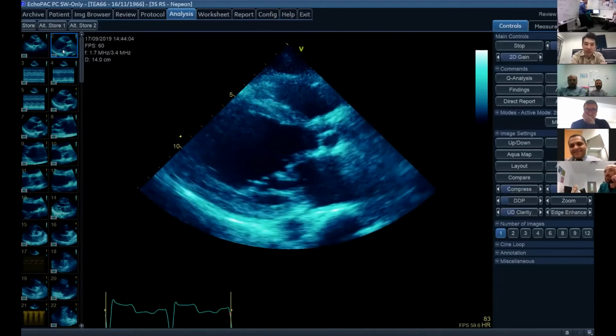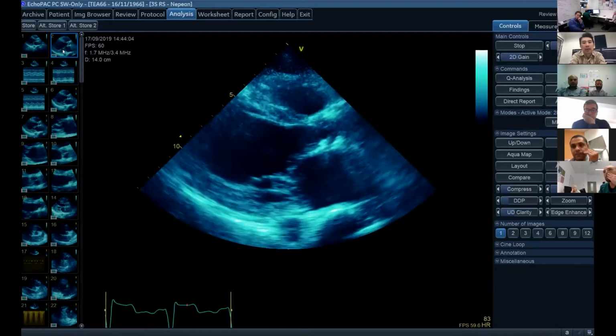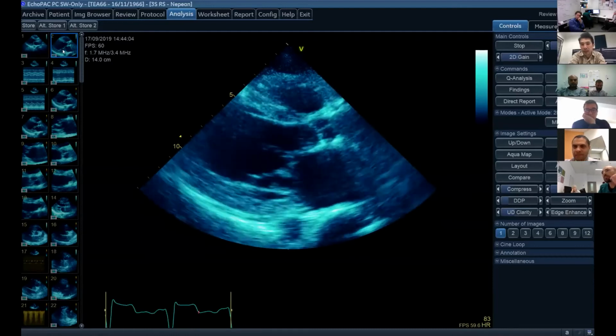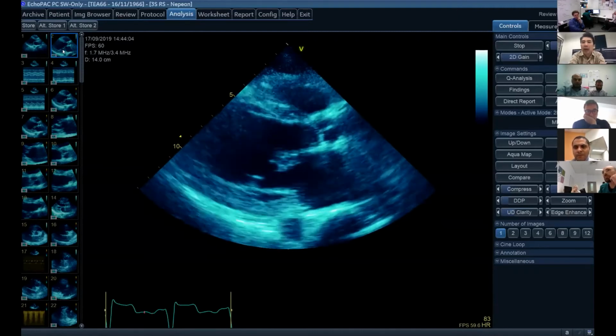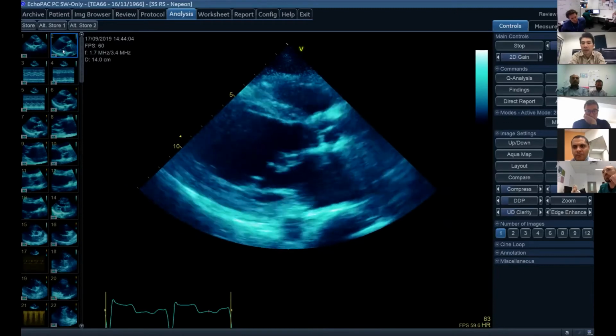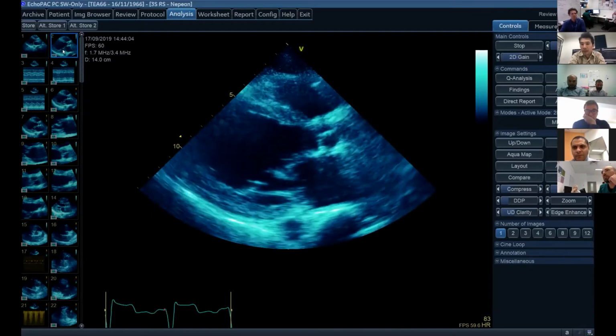So in this parasternal long axis view, we're seeing that the LV is very dilated. The left atrium also looks enlarged. I'm very concerned about severe segmental dysfunction. I can see that the anteroseptal region is particularly affected compared to the posterolateral, but both are affected. The mitral valve annulus looks enlarged, and the coaptation is well below the annulus, so it does look restricted.